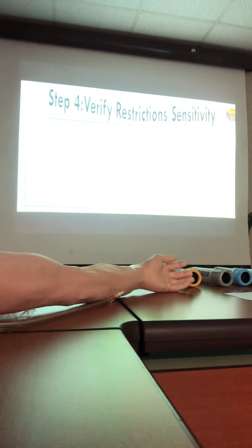Any patient during the fasting hours can drink water, except in the GTT, the glucose tolerance test. In the OB, we are doing it for gestational diabetes. In the OB, after the patient drinks the solution until the procedure is finished, the patient cannot drink water because the water will dilute the amount of the sugar. Okay, this is the only test where the patient cannot drink water.